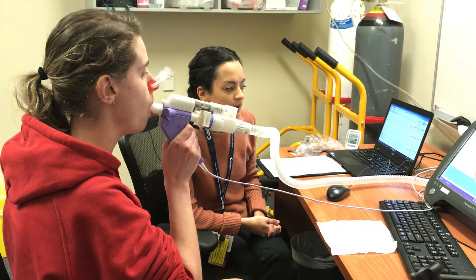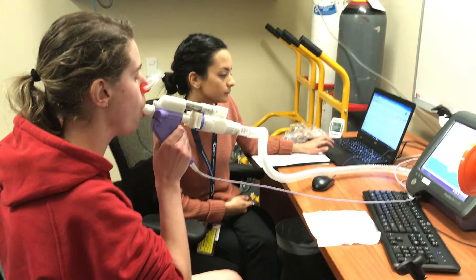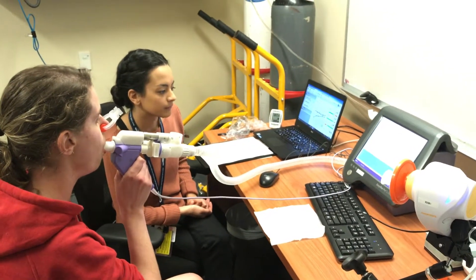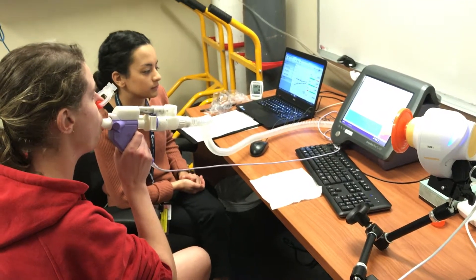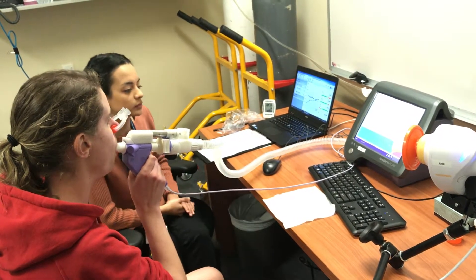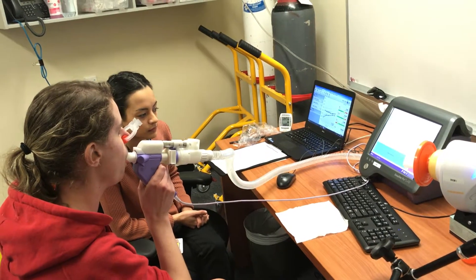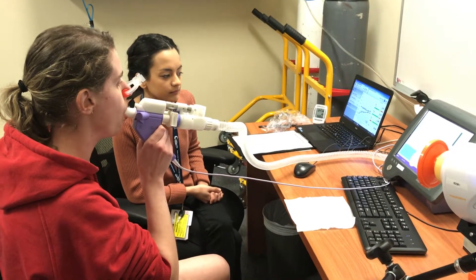Beautiful. In the next couple of breaths, you'll start hearing some noises, so let's just keep going as normal. You're doing well. Just aiming for that range. Beautiful job.